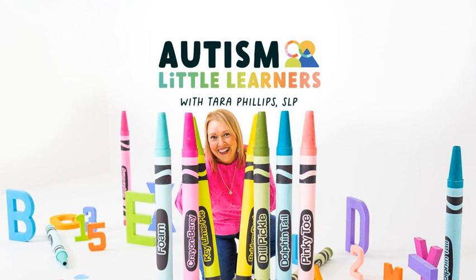all valuable learning spaces. So at the grocery store, you could model cart, apple, want, more. At the playground, model slide, swing, run, fun, stop. At the restaurant, eat, drink, want, all done. And during errands, you can model go, wait, help, finished. Each outing provides opportunities to model and practice AAC in real contexts.